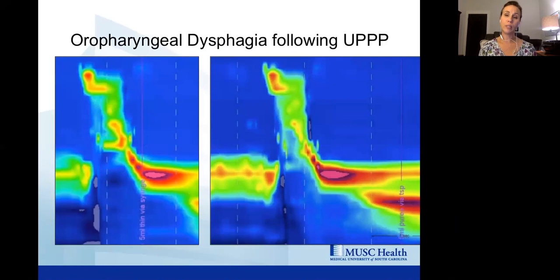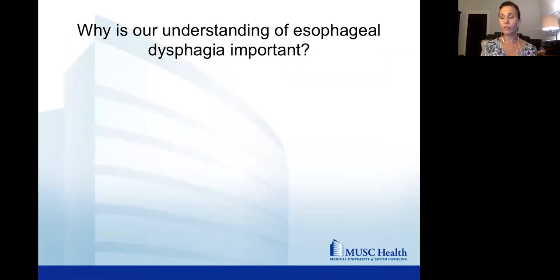And what we found were these subtle differences in that almost the simultaneous contraction that he had here, as well as decrease in those mesopharyngeal contractility. So although in video fluoroscopy, he was more kind of within the normal limits, or we may say his tongue base may be a little bit weak, here in high resolution manometry, it gave us actually a therapeutic target or even an explanation for why he may be feeling a difference with his swallowing, even if we weren't seeing a functional deficit on video fluoroscopy.